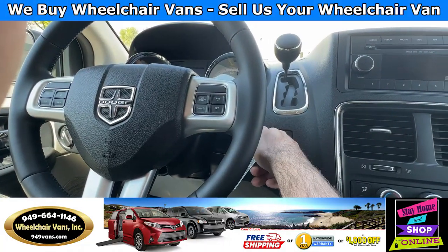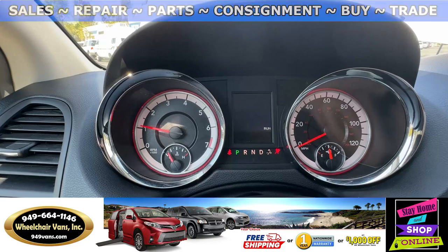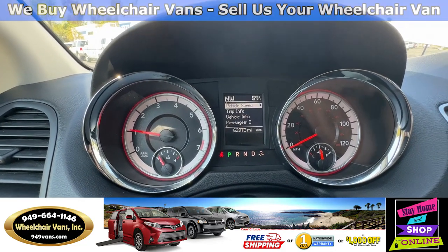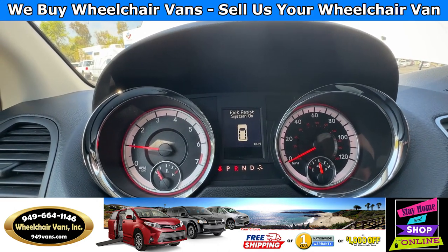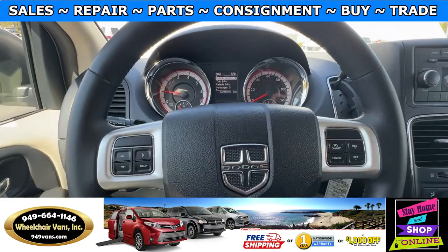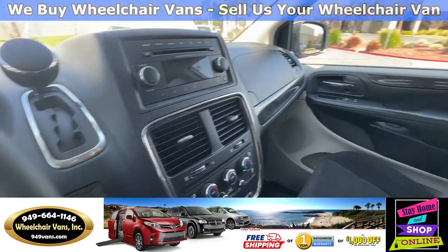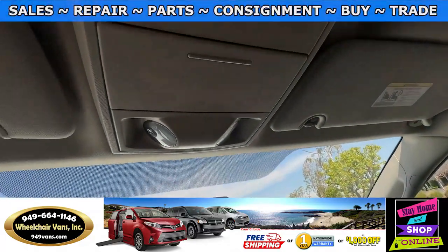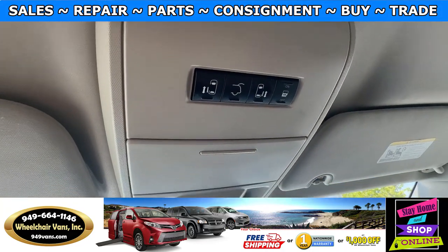Let's go ahead and start up the van. This is going to have 62,000 miles. It will also have the park assist. You have the cruise control. And this is going to have the cloth seats. And up here, you have the controls for the automatic sliding doors and rear hatch.